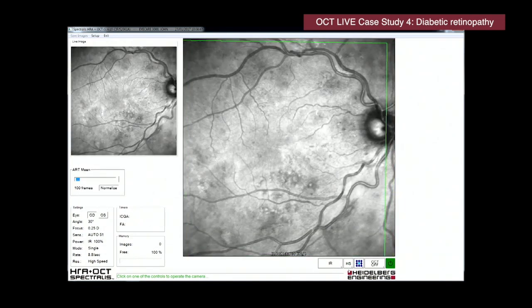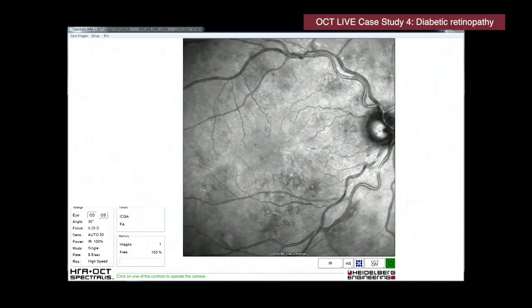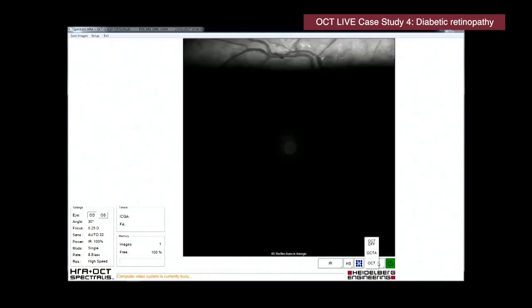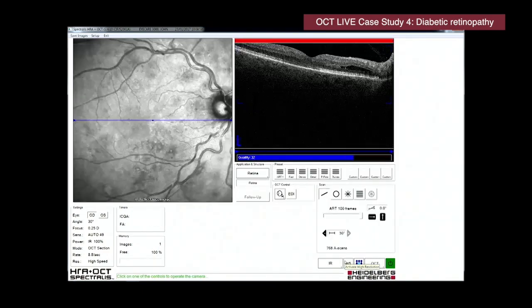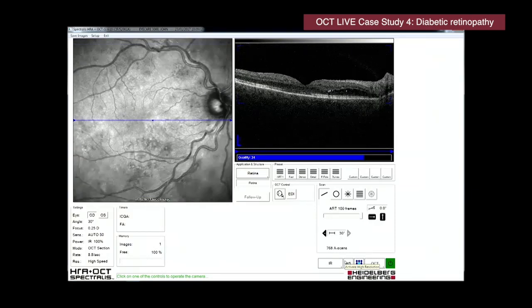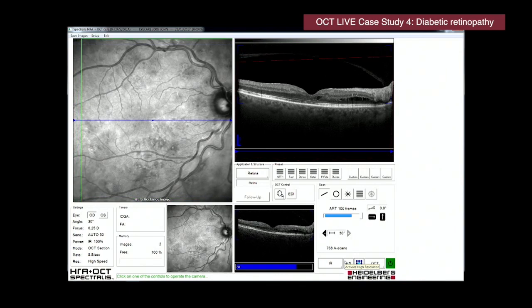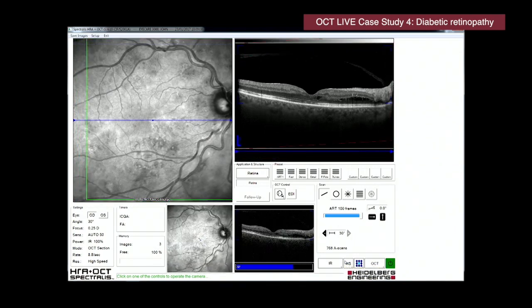Right, okay, so once again, the infrared reflectance image is highlighting a lot of changes here. So we can go on to the OCT now, Phil. And again, we can start to utilize information that we have here. So we'll start out with a straightforward macular-centered line scan. We track, acquire an image, and then simply where we're seeing a change.